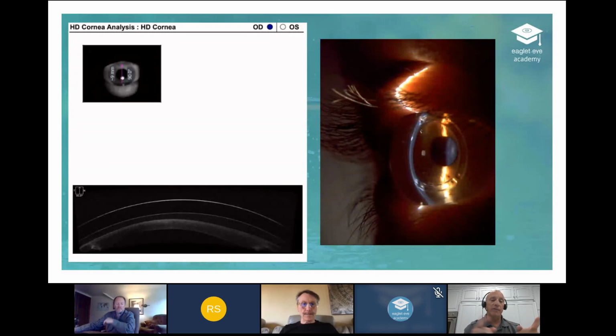Earlier there was an example of a nasal and a temporal pinguecula. Unfortunately, right now, a Zen lens, for instance, can only do one side. They're going to try to do 2. A Boston Sight can make 2 channels, so if I see that, it's going to help direct me which type. Also, the One Fit can do it. So sometimes those are part of your decision making.